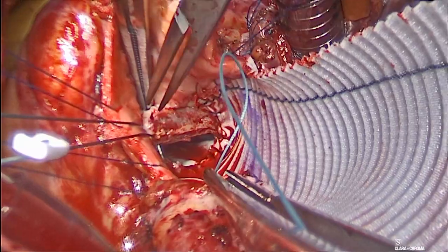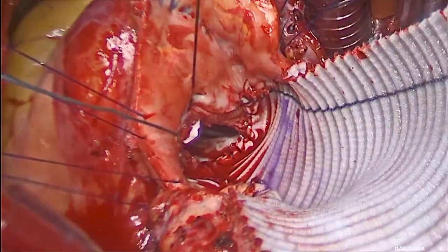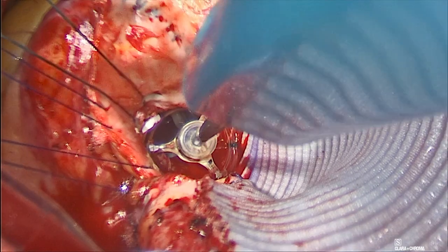We placed the first commissure stitch and then used the valve sizer to determine the location of the other two commissures after enlargement.